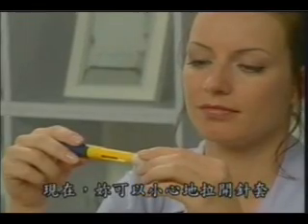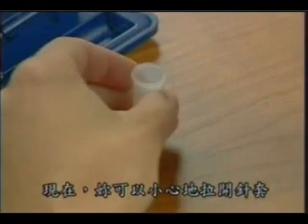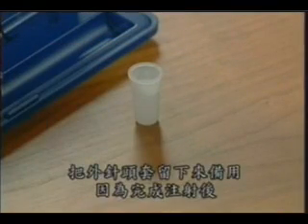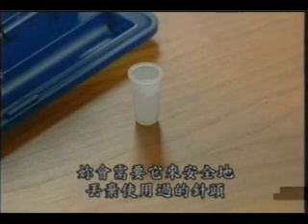Carefully remove the outer needle shield by pulling gently. Leave the inner shield in position. Do not throw away the outer needle shield. You will use it to safely dispose of the needle after the injection.